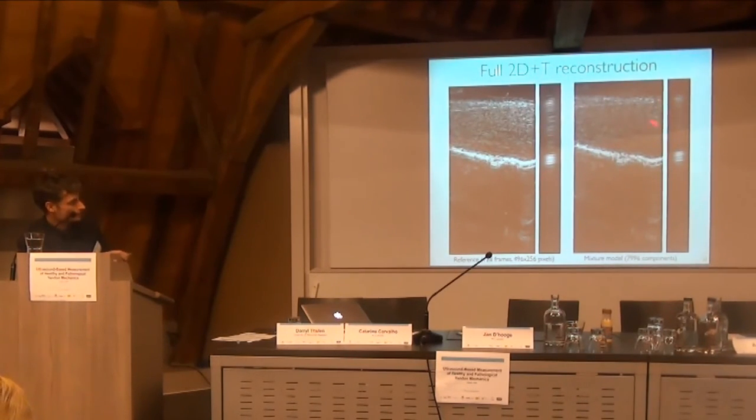And here you see the approximation of this data set with about 8,000 Gaussians. So much fewer mixture elements than pixels in your input data set. And to each of those image elements, you have an explicit motion vector that is estimated as well. You can extract it from the covariance matrix of your Gaussians.